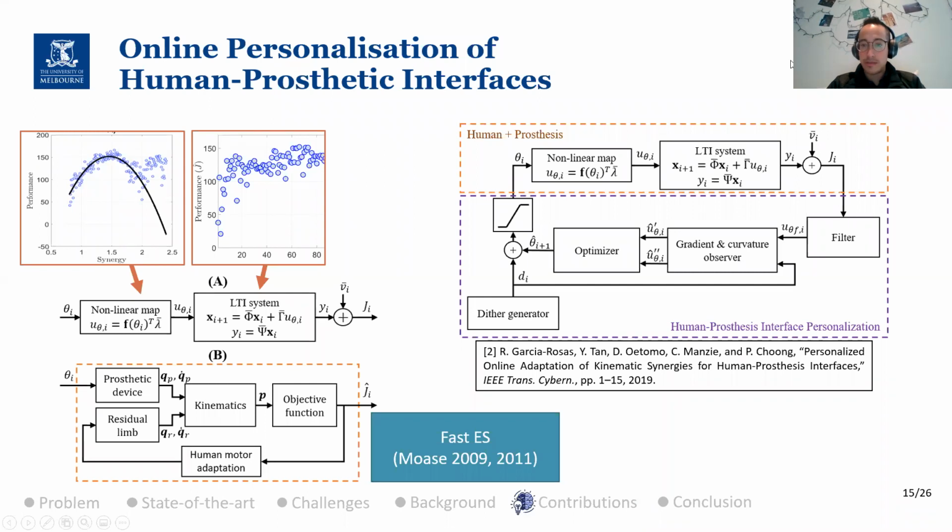The algorithm in general, the entire system would look something like that. So there are some differences with extremum seeking, but the main point is that it allows us to take advantage of our knowledge of the relative degree of the learning dynamics, or the shape of the learning dynamics, without having to know particular parameters for each person, right? So we only need to know what sort of shape this LTI system has, what's the relative degree of the LTI system, and then we can design our algorithm, which is a big step up.